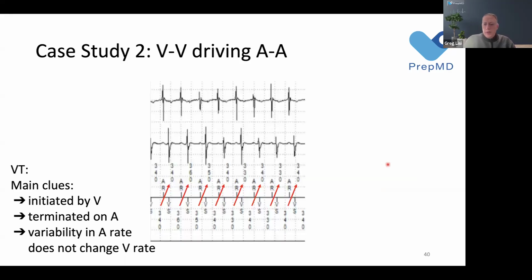I know when we teach our students here, we say, imagine you're going in front of a judge and you've got to present your case, right? You never want to go to the judge with only one piece of evidence, right? And it's just the same way as we're making our clinical decisions. And that's why, going back to our early discussion on discriminators, it's rare that we're going to use something like onset alone by itself, right? We want to have multiple pieces of data that's going to help us drive our decision. Great point.